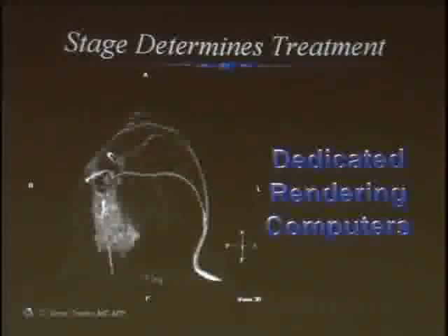This kind of stuff that you see right here, rolling around in 3D space, this is not normal breast MRI. I got to tell you, this is all about that state-of-the-art stuff. This is all about going to the experts. I've spent an extra $200,000 on a computer that allows me to do this. I talked my bosses into buying it for me. And it makes a huge difference to be able to see the data in this way.